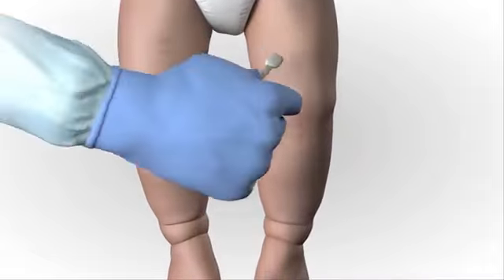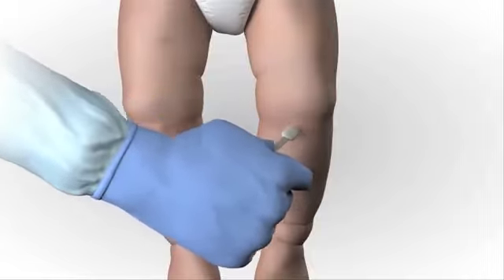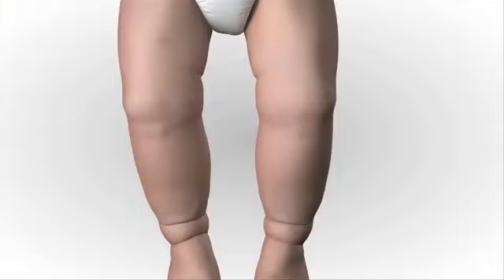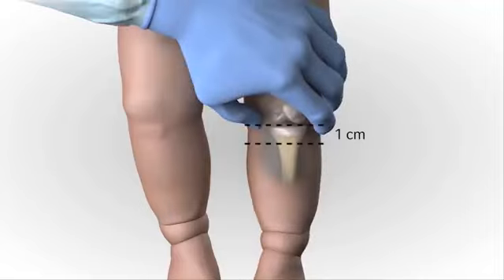Extend the leg. Prepare the site by using antiseptic of your choice. Use a clean, no-touch technique. Insertion site is approximately 1 cm medial to the tibial tuberosity, or just below the patella, approximately 1 cm, and slightly medial, approximately 1 cm, along the flat aspect of the tibia. Pinch the tibia between your fingers to identify the center of the medial and lateral borders.